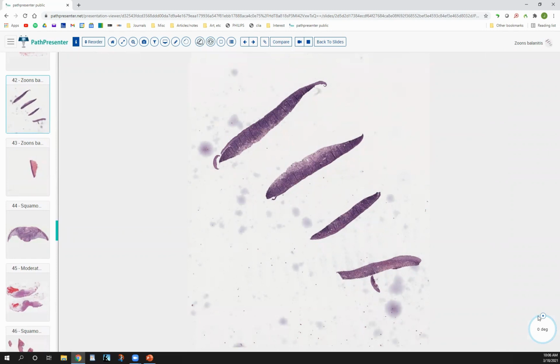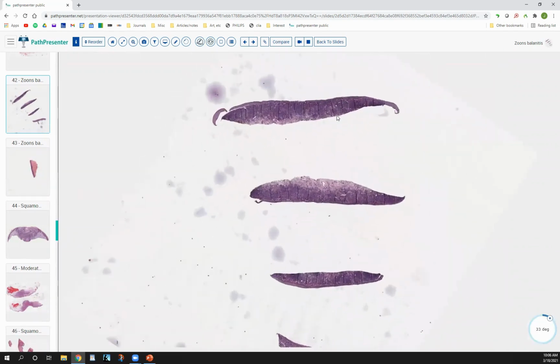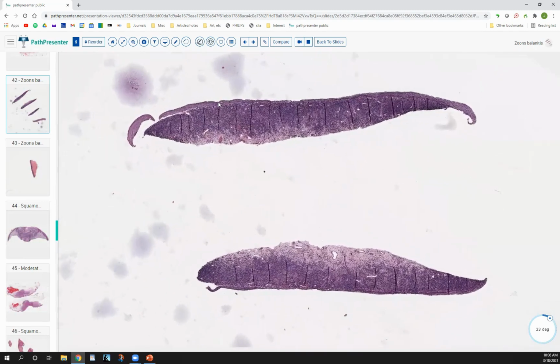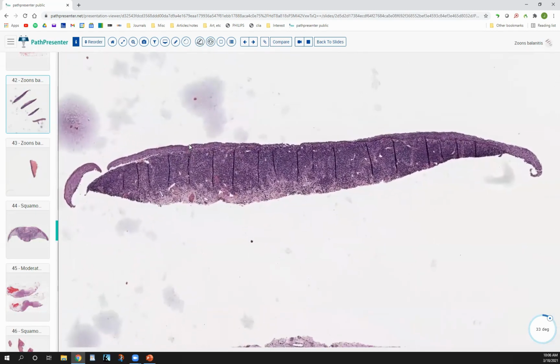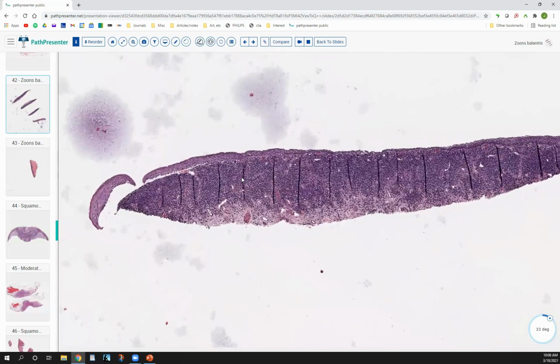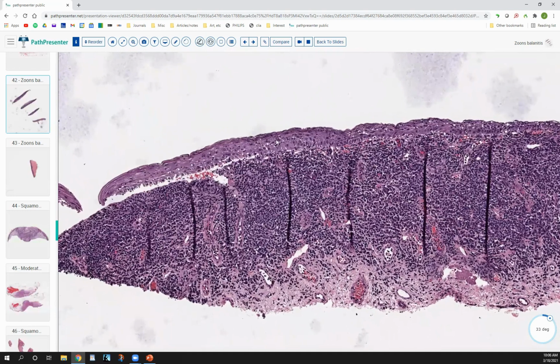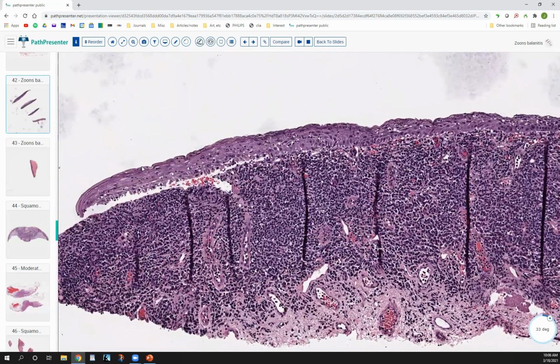So here is, again, we haven't left the location, so we're still in the genital area. But if you look at the epidermis in this case here, it doesn't look as bad. And there's a lot going on underneath, which we'll get to in a minute. But the actual epidermis, I think, looks atrophic in some areas, not thickened. And even in the areas where it's not atrophic, it looks pretty bland. You don't have that nuclear hyperchromasia, pleomorphism, overlapping nuclei that you had in squamous cell carcinoma in situ.